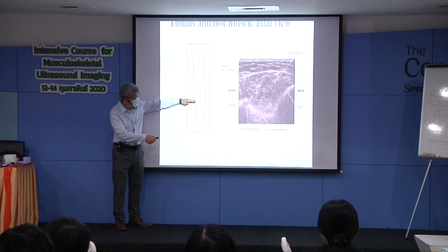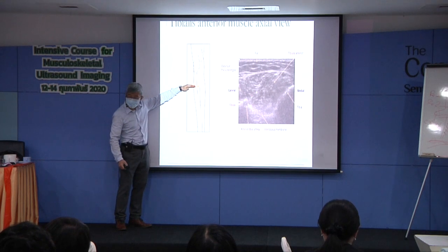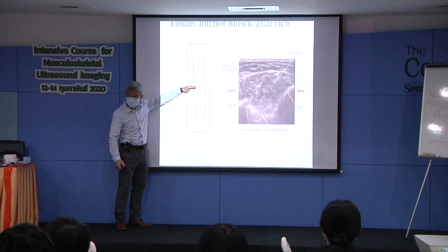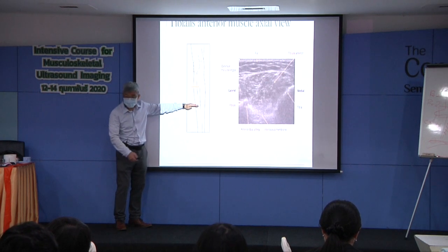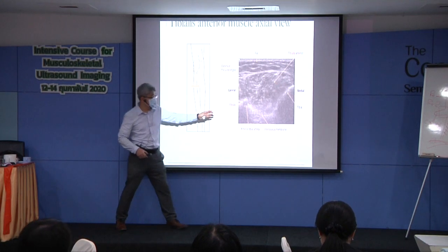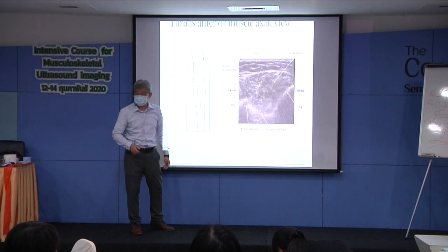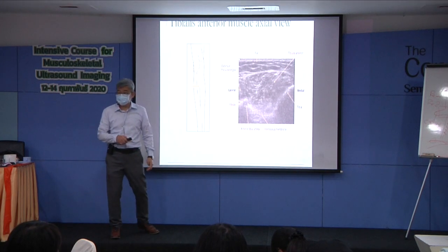There are no margins, right? It's 1, upper third. If you move the probe to the middle third, there is a margin in here. So if someone shows you a picture, you have to look at it and tell, this is an example of tibialis anterior.